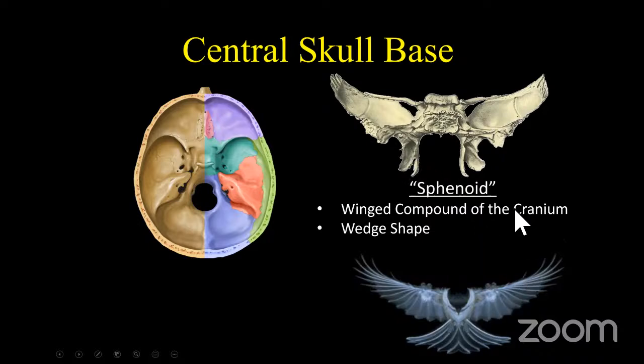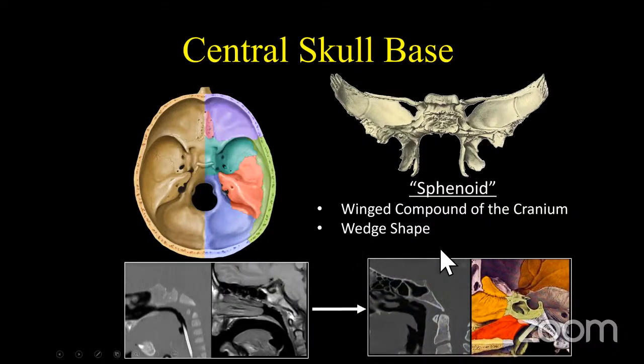So for those radiologists or the younger neurosurgeons out there that sometimes struggle with understanding the various components and really getting a better understanding, just remember that the sphenoid bone is just like a bird. So when we have development of the sphenoid bone, initially there is a small little gap right here. And this is what we radiologists would sometimes call a pseudofracture.